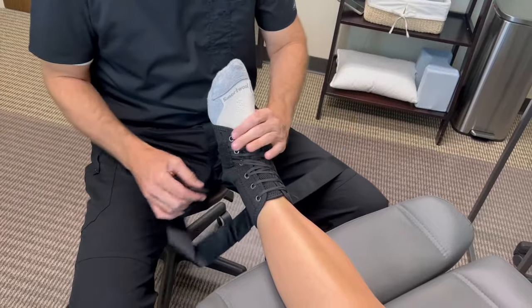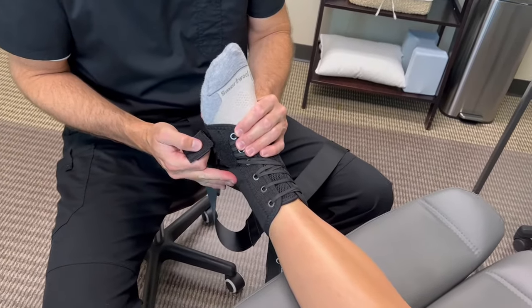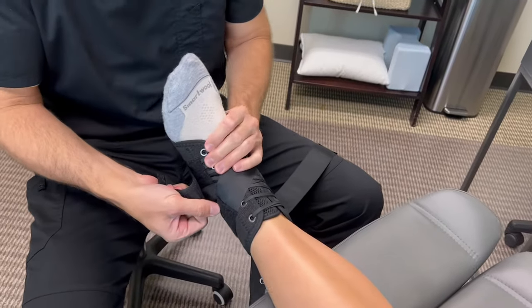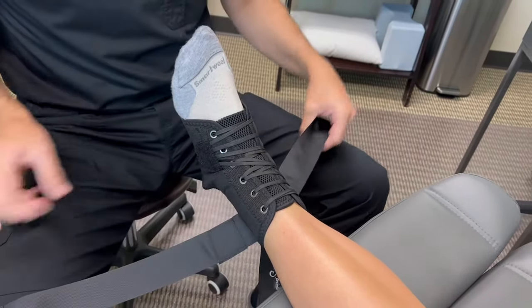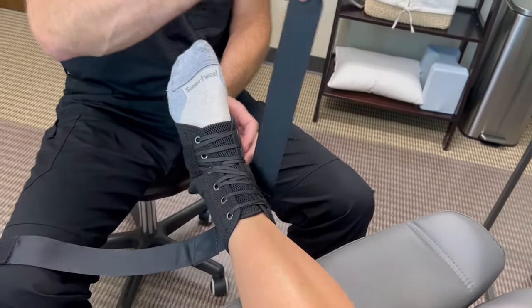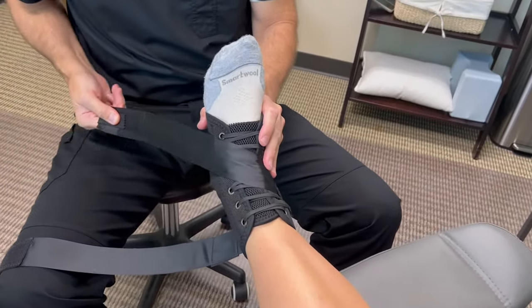If you have problems with the lateral part of your ankle, you're gonna want to put that one on first to hold your ankle this way. If you're having problems with the inside or the medial side, you're gonna want to put that one on first.